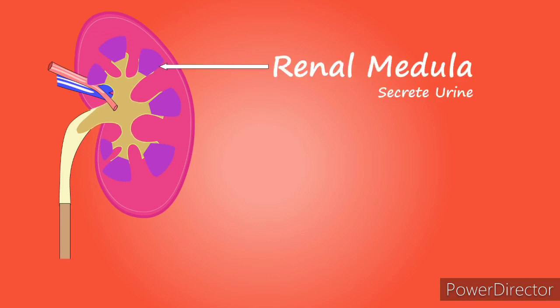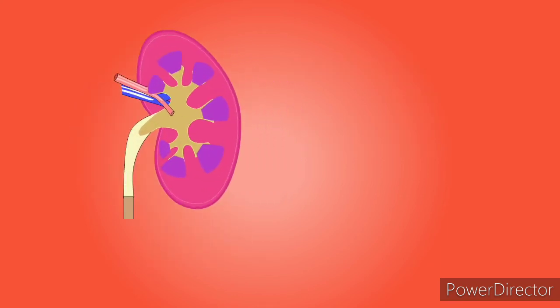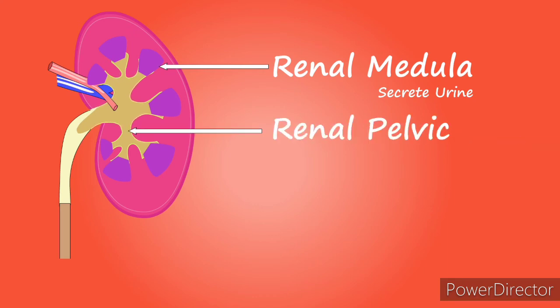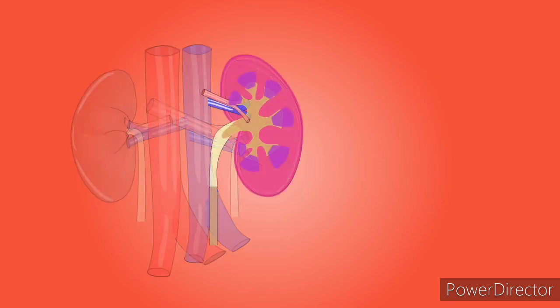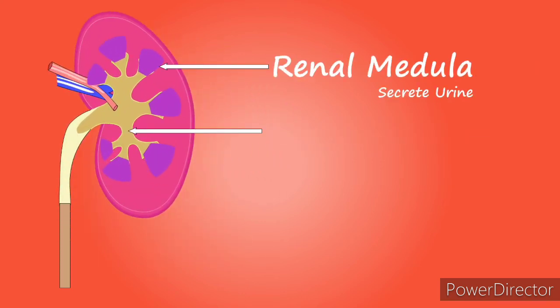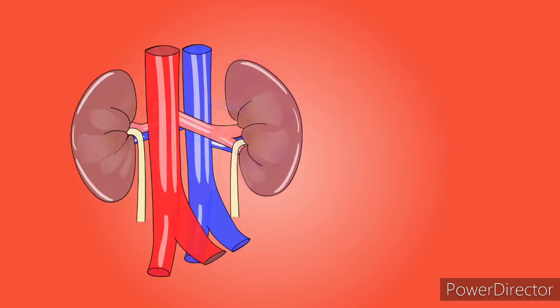There are some other normal conditions where urine can also be bloody, like when a female is menstruating. There is no disease condition causing it. It is normal. So outside when a young lady is menstruating, when the urine appears cloudy, and in males too, it's good to do this urinalysis test.